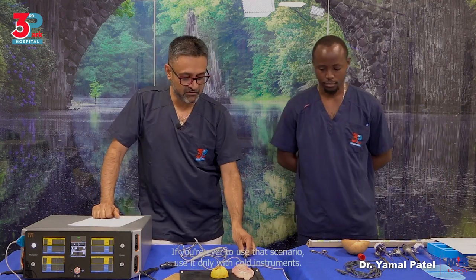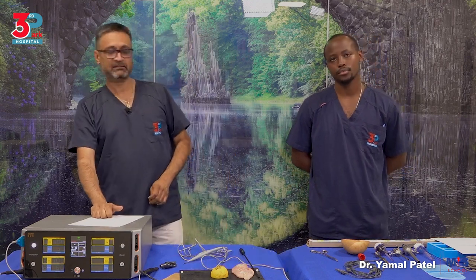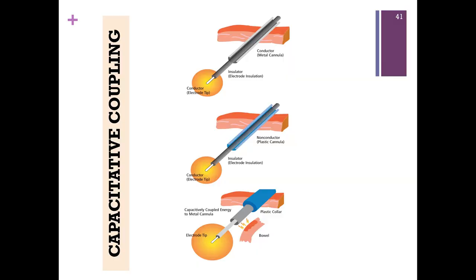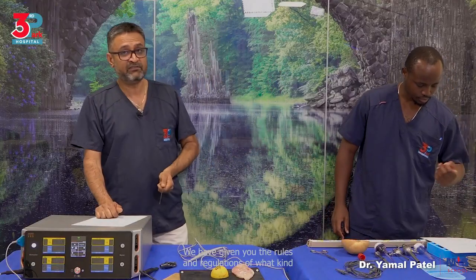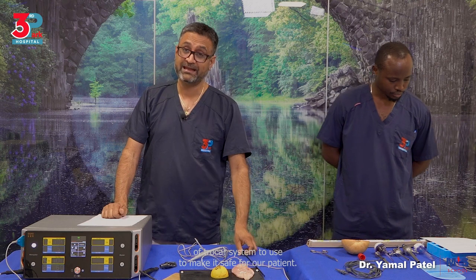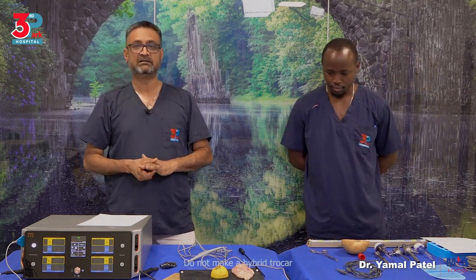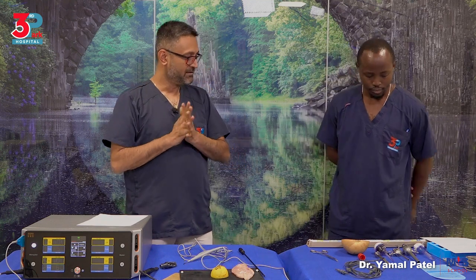Okay? If you're ever to use that scenario, use it only with cold instruments. Okay? So, we have covered capacitive coupling, we have covered the electromagnetic field that creates conduction of electricity, we have given you the rules and regulations of what kind of trocar system to use to make it safe for our patient. Do not make a hybrid trocar.